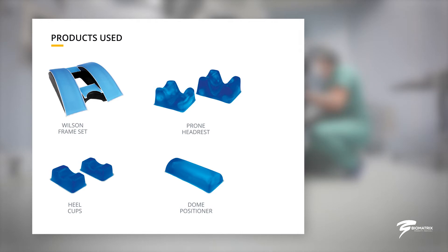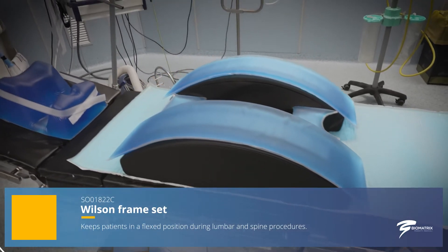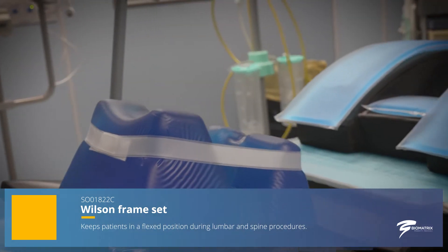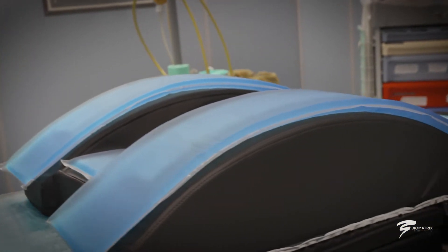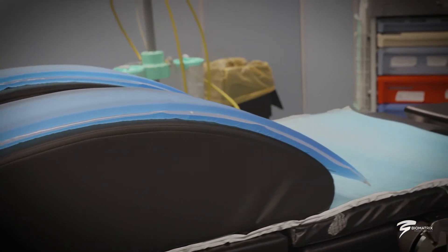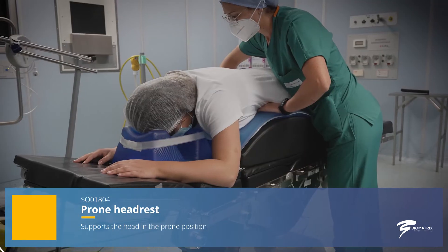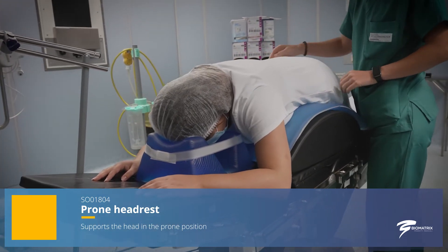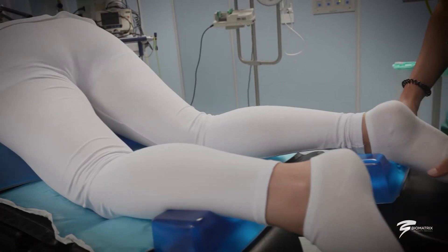A line of gel positioners addresses the risk of pressure injury for patients undergoing surgery, who may be forced into the same position for hours. The compact composition and density of the gel positioners allow them to adapt to the body surface in an optimal manner, allowing the patient to rest safely and comfortably on the operating table.